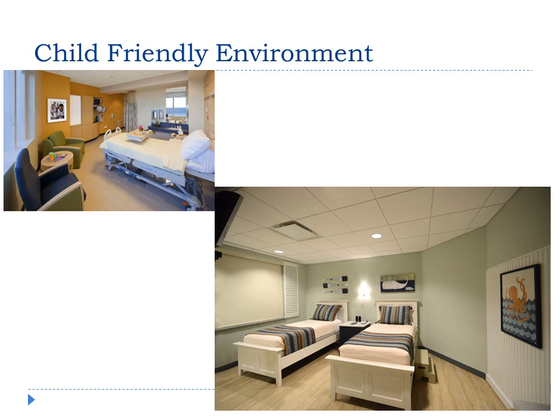The staff should dress in scrubs that would be pleasing to the child's eye, whether it's, again, animals or cartoon figures, whatnot. All equipment should be out of sight for the child. It shouldn't be glaring there that they are here for a sleep study. You want to have that hidden away in cabinets and whatnot. Along with this, you want to have the safety cover plates over all your electrical outlets. If you're doing a sleep study on a baby that needs to sleep in a crib, have a crib there for them where your equipment can get to it easily. But again, you want to keep the equipment out of sight.